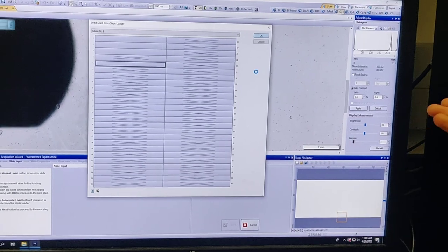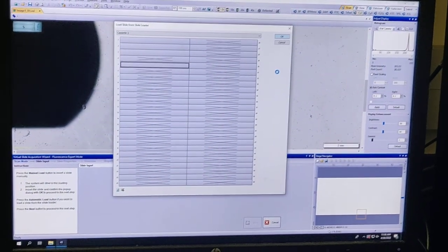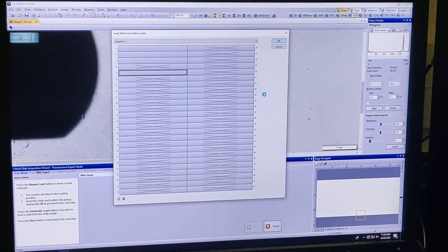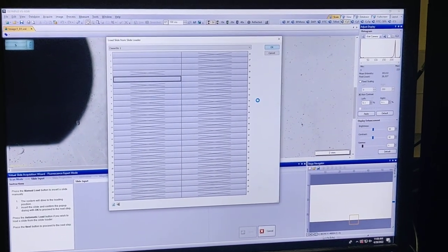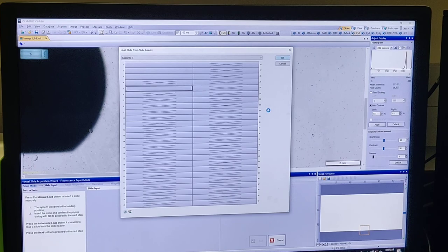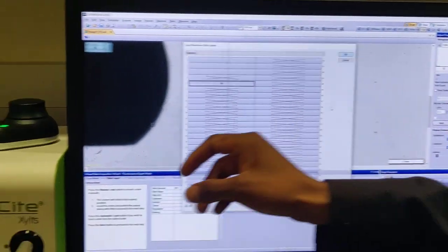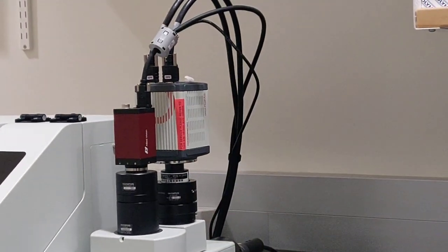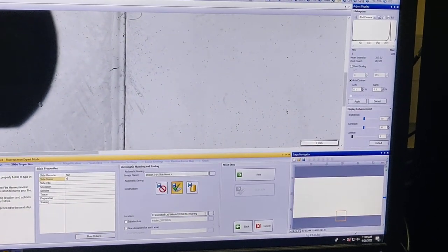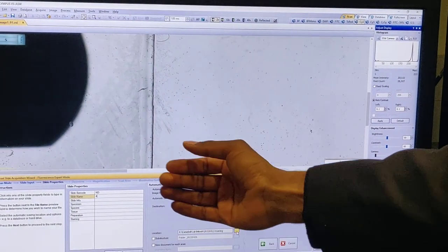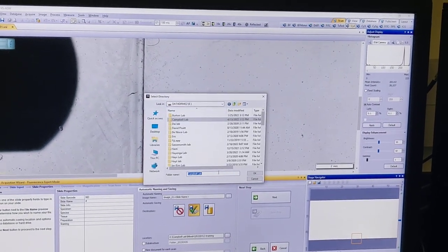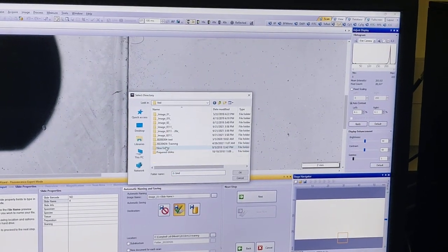The same scaling protocol is applicable for batch scan mode as well. So far we have been using the color camera for bright field; now we will be using the monochrome camera. The apps for bright field and fluorescence are different, so you will have to reset the storage location. Each lab has their own folder, so we keep it there.